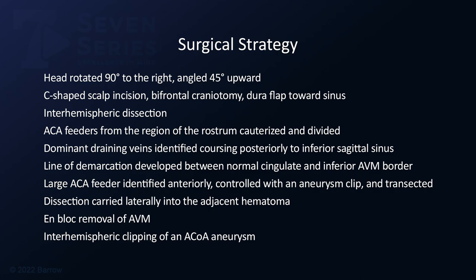Dissection laterally into the adjacent hematoma, and finally, en-bloc removal of the AVM. Lastly, an anterior communicating artery aneurysm, which was identified angiographically, was then clipped through the interhemispheric corridor.